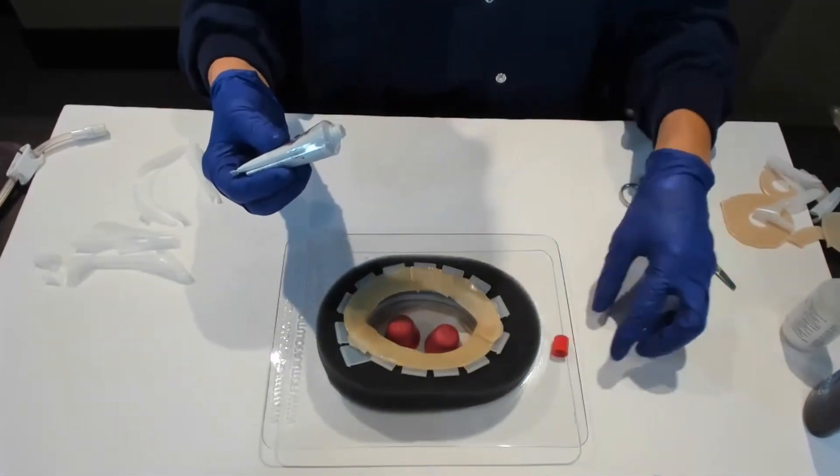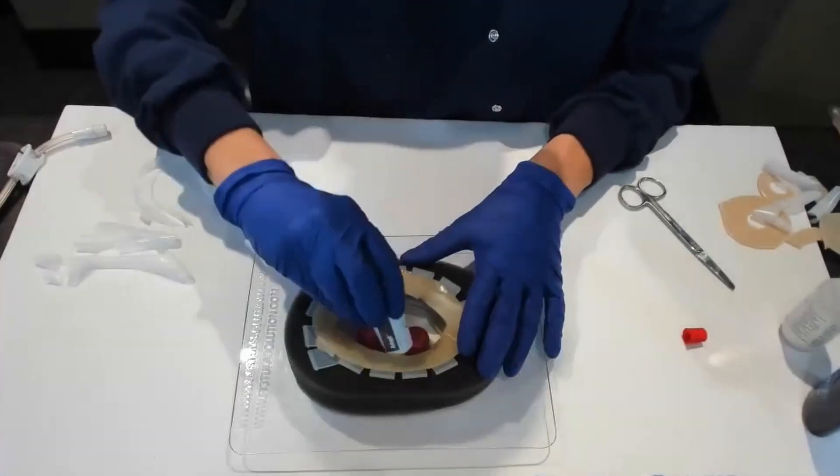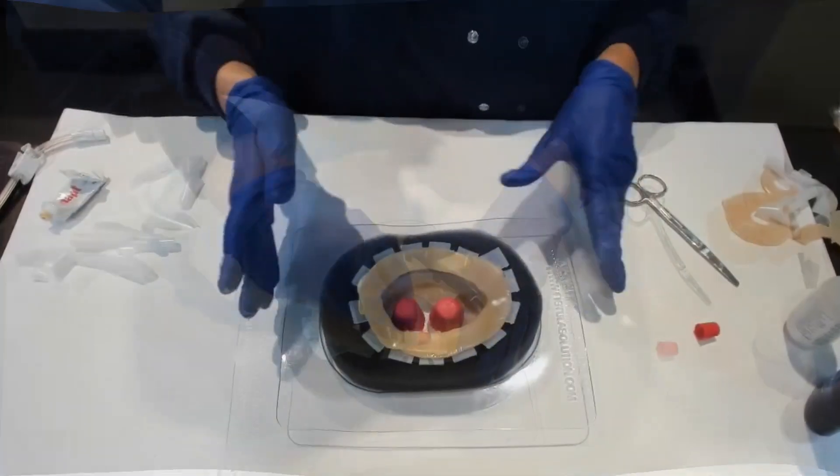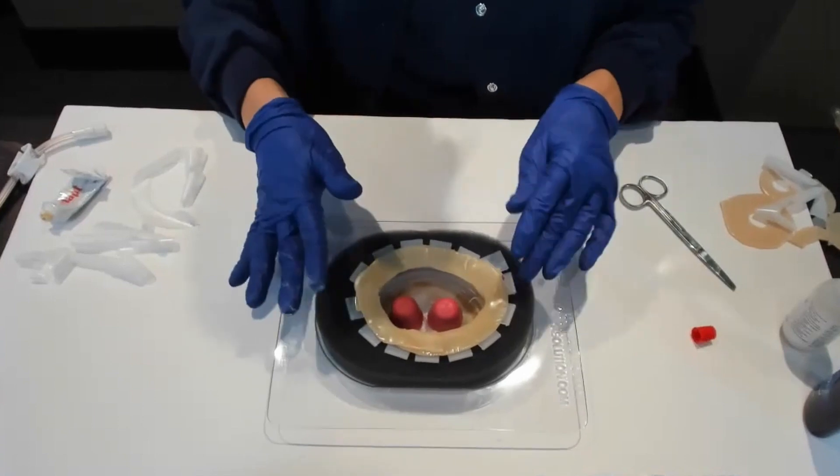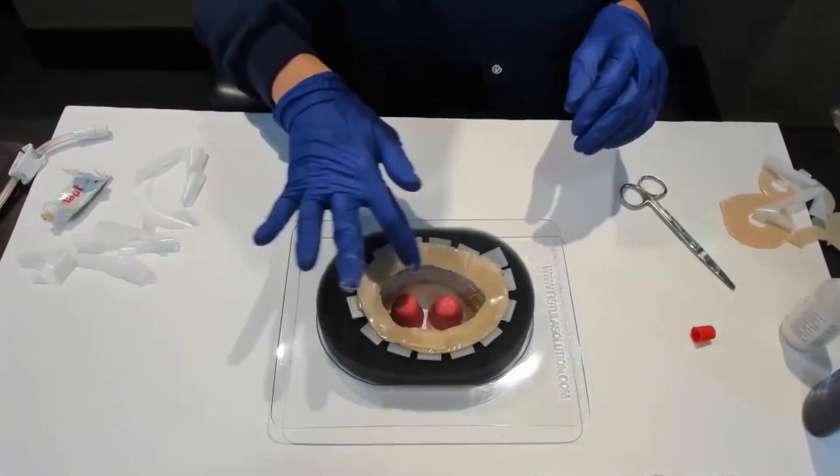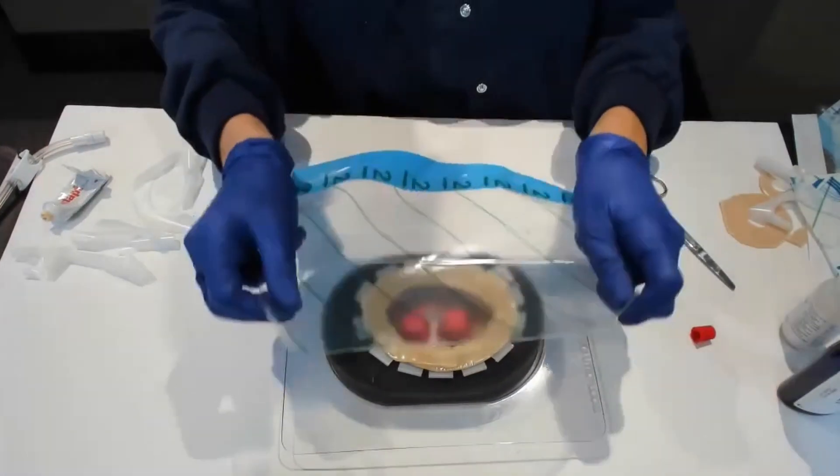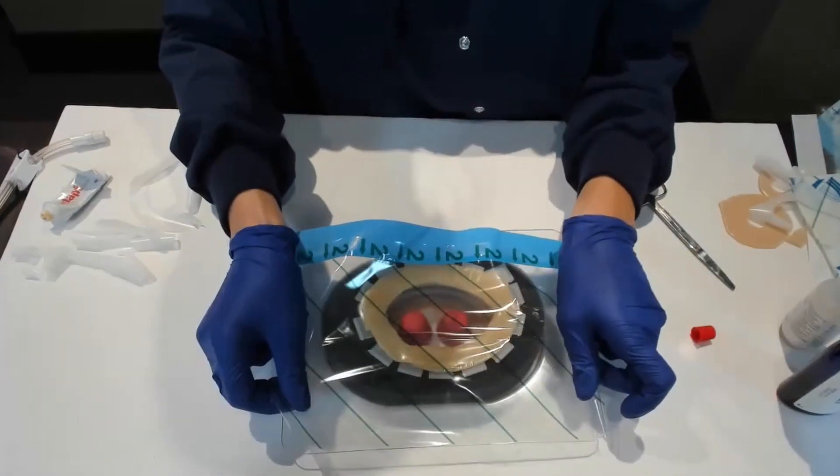I put a little bit of stoma paste at the base. Then we're going to try and seal this up now that we have the hydrocolloids at the top, the base, and then there's stoma paste on the inner ring. I just set it over there on the tray.